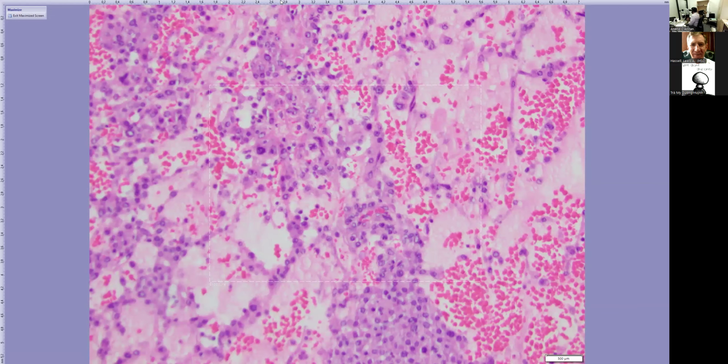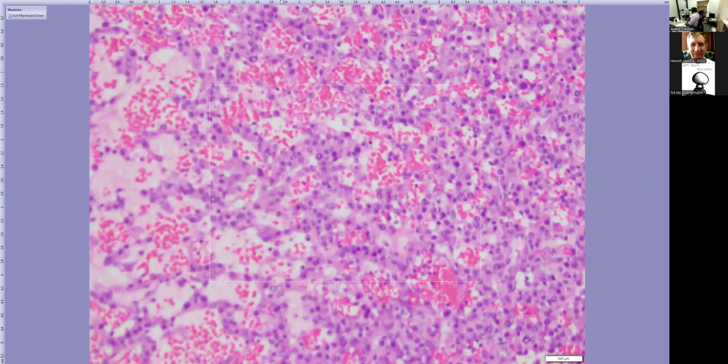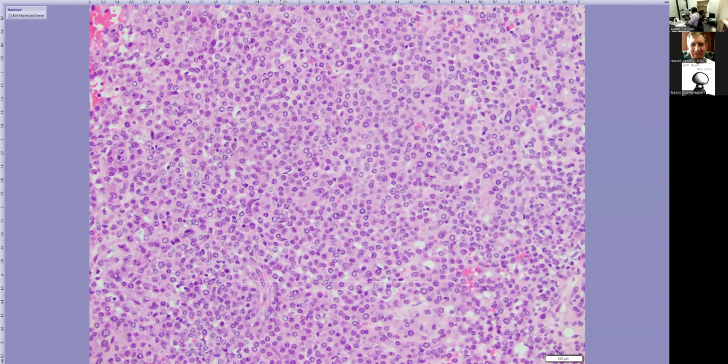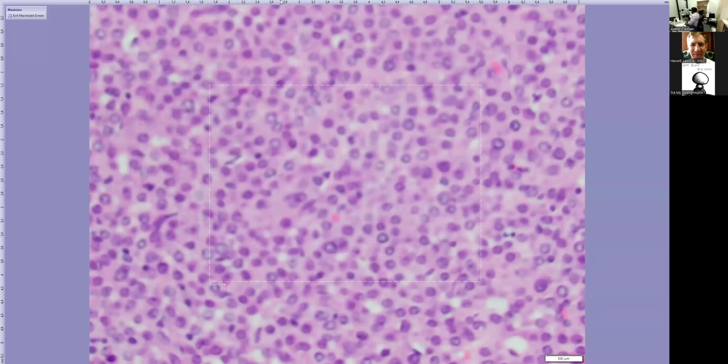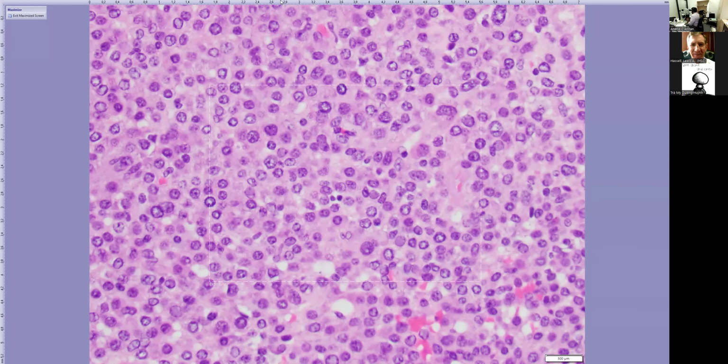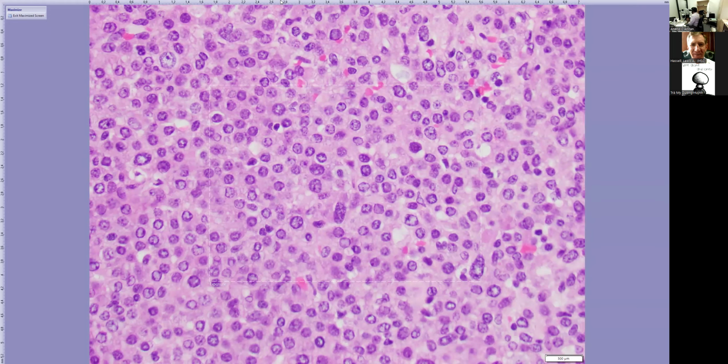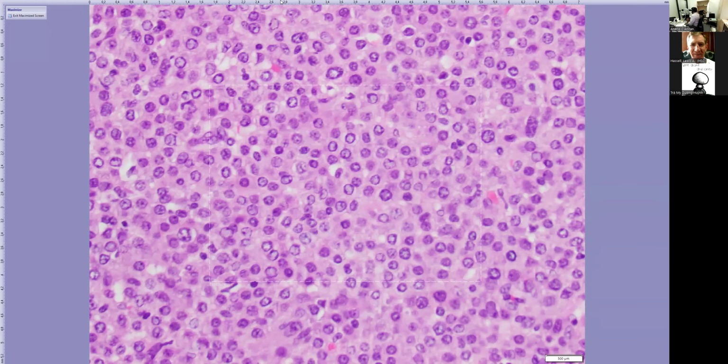If you look at the histomorphology and cytomorphology of these tumor cells themselves, they are relatively polygonal. They have a mostly round nucleus. There is some variability in size and chromatin condensation, but overall, they appear to be a little bit bland. There are no prominent nucleoli, and there are not that many mitotic figures. If you hunt them down, you can find a few, but by far they are pretty rare. And the cytoplasm of these cells has a little bit of a pinkish hue.